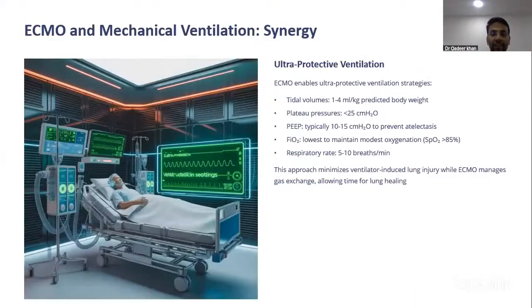As I told, for the patient, we need to understand that it's not just the ECMO physiology. We are connecting the patient to an ECMO, and we need to know that the lung pathology or cardiac pathology which was there, we have to address that also. We have to give that rest. That should not be forgotten by considering only the extracorporeal life support and forgetting the normal physiology of the patient. We need to monitor all those things simultaneously, at the same time.